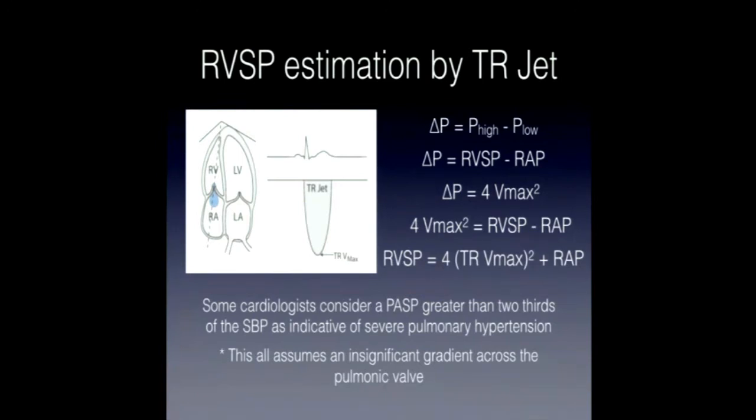Good point. It does not. Yeah. And pulmonary stenosis is quite rare if you're not dealing with a congenital population. So I try and hunt down a lot of pulmonic valves, and I find they're like trace PR.